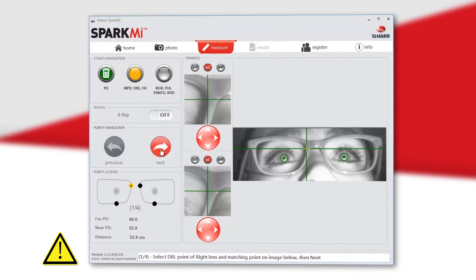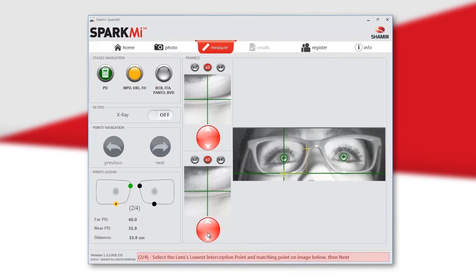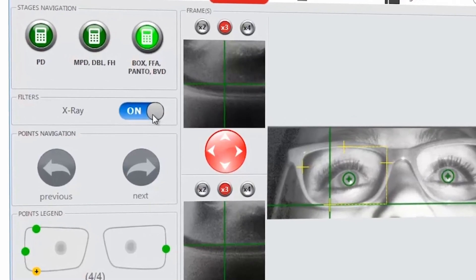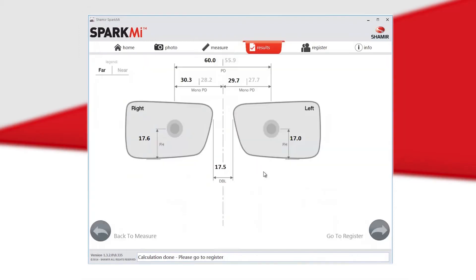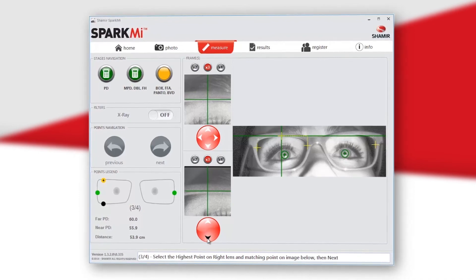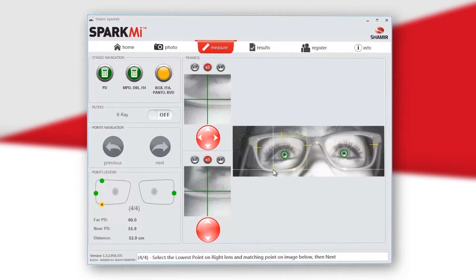Not doing so will result in inaccurate results. The point you will need to mark is shown in yellow on the frame illustration, with an explanation shown at the bottom of the screen. Turning on the X-ray button will allow a contrast view of both small images. The first four points will measure fitting height and distance between lenses. After marking these points, the fitting height and DBL are set. The next four points measure the box, back vertex distance, face form or panoramic angle, and pantoscopic tilt.